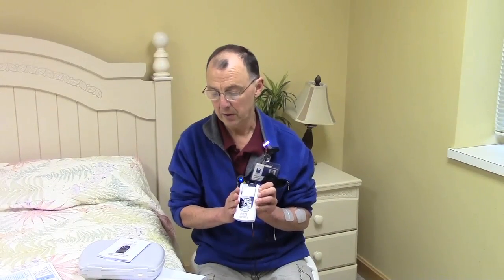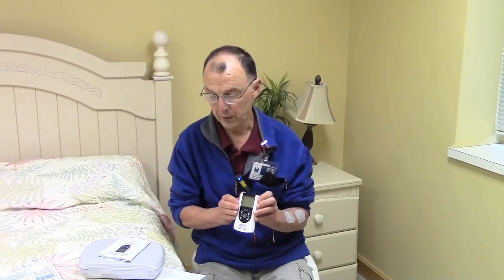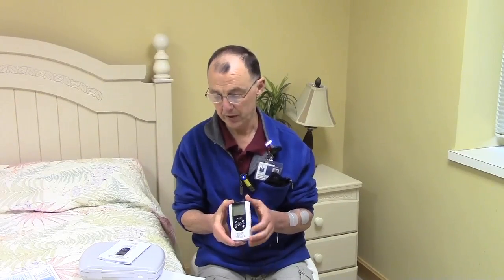Before you start, a therapist should get a doctor's order to use electrical stimulation. Or if you are going to try to do this yourself, you should talk to your doctor first. If a patient has a pacemaker, they should avoid using electrical stimulation — that would be one precaution.